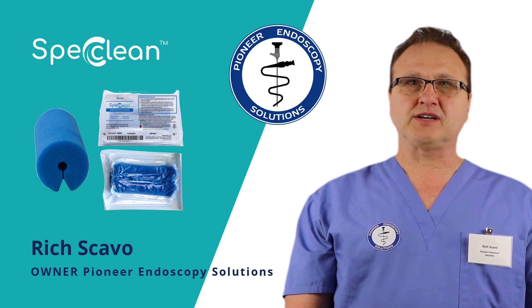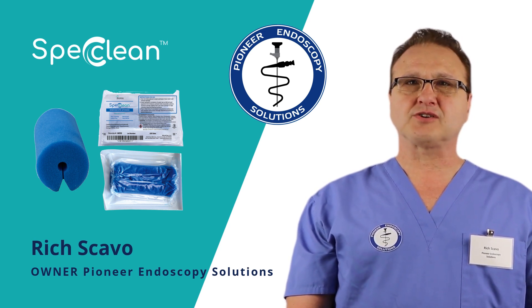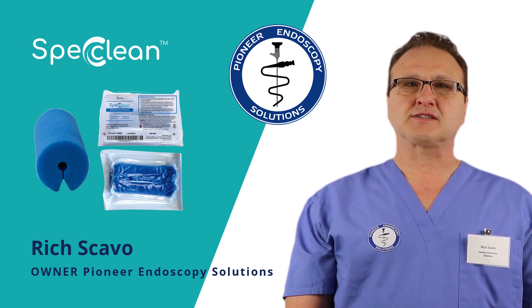Hi, I'm Rich Scavo with Pioneer Endoscopy Solutions. Today, I'll be showing you how to clean your endoscope using the SPEC Clean Endoscopic Sponge. Let's dive in.